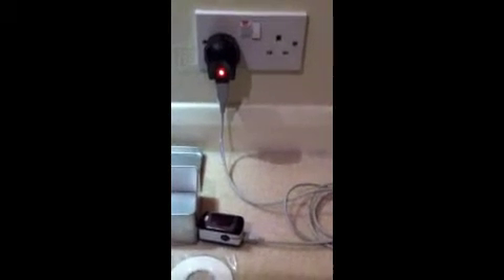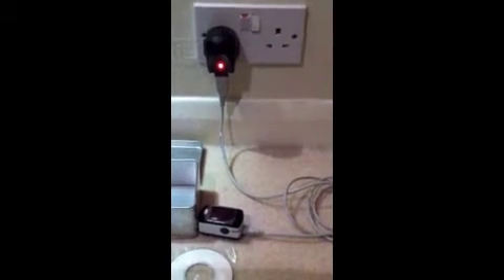When it's fully charged, the light on the plug itself should turn green.